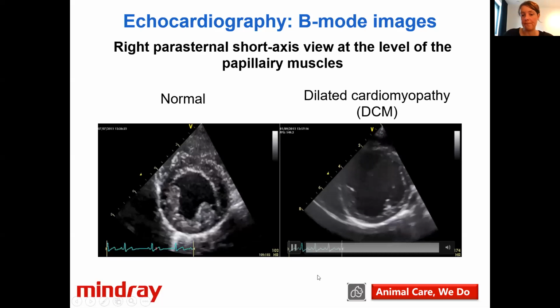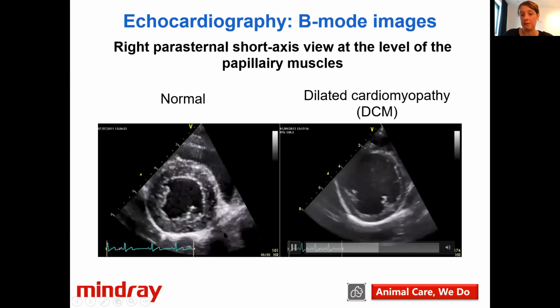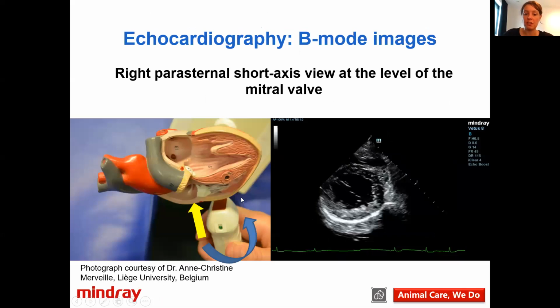And we move on to the next image. The thing about making these images is that we make all of them in a fluid movement. These are really small movements, because we continue our turn a little bit, but mainly we also start to lift our cable a little bit. If you see how we are transecting the heart, we started making a line here at the papillary muscle, where we are transecting the heart at the level of the papillary muscles. What we want to do now is look at the mitral valve. In the model the mitral valve is removed, but actually it's lying here.